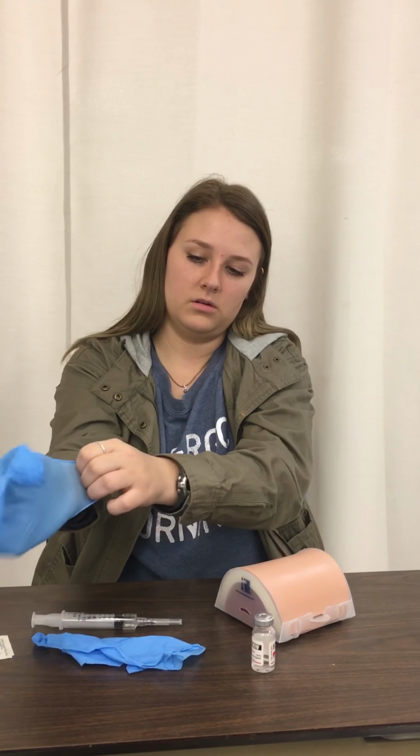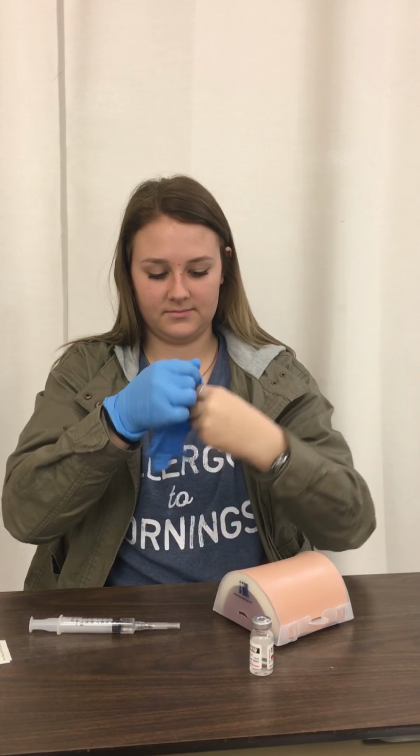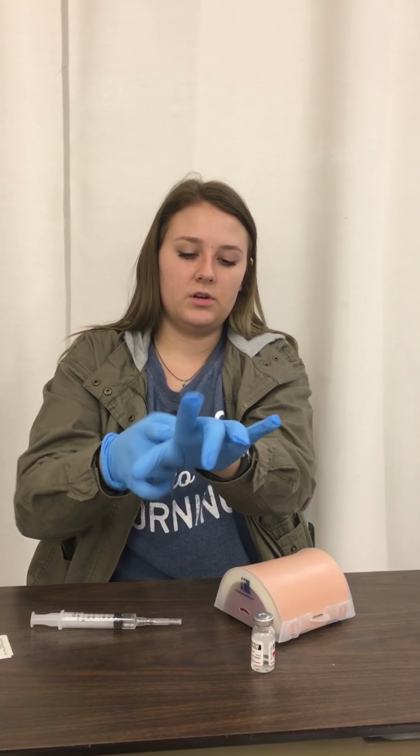Okay, so you're going to the patient's room and you've cleaned the site. You're going to have your gloves on. If I can get them on. And after you clean that site, you don't need to pinch up to get fat, but you can kind of hold to get the muscle to stay in place. You're going to pinch to make sure that muscle stays in place. And when giving an IM, it's a 90-degree angle for the IM injections.